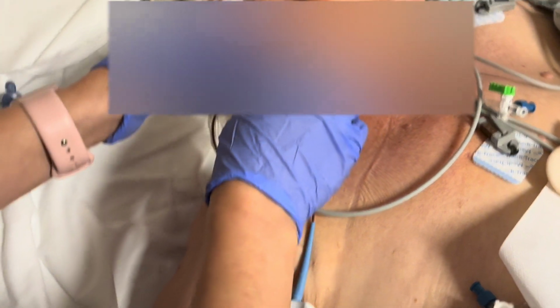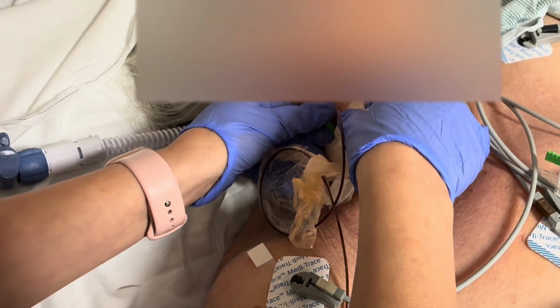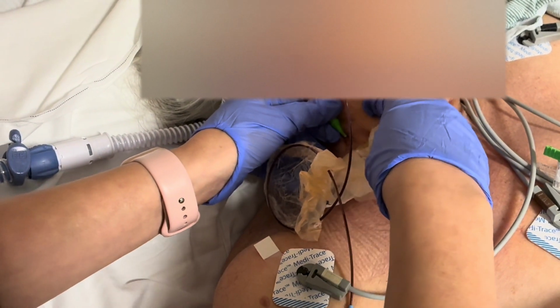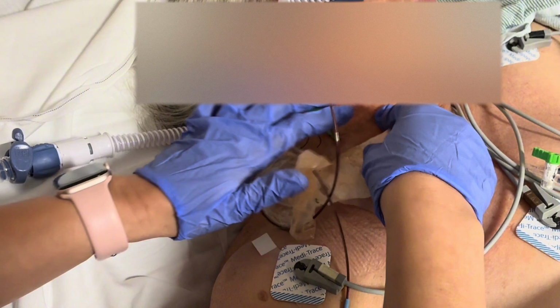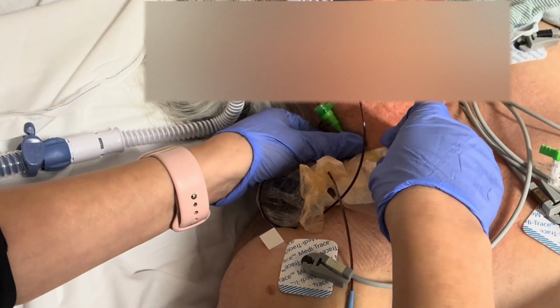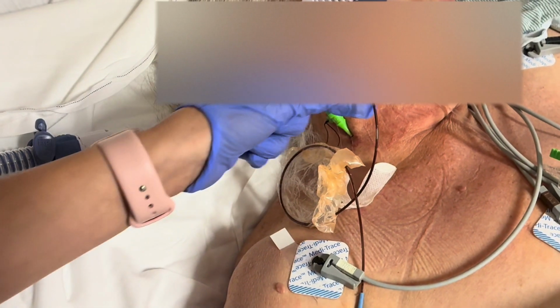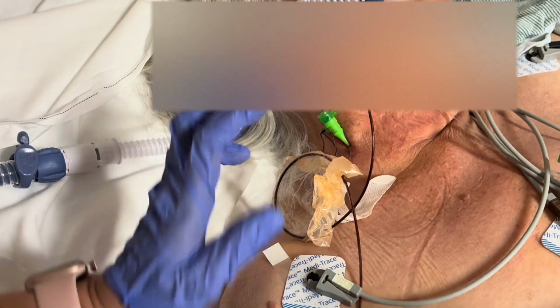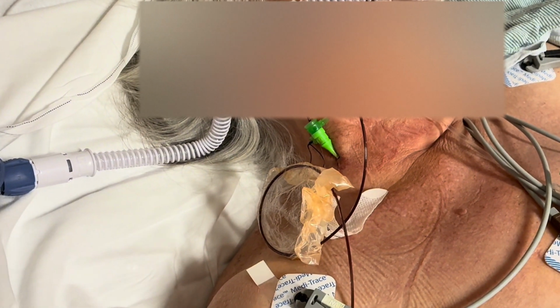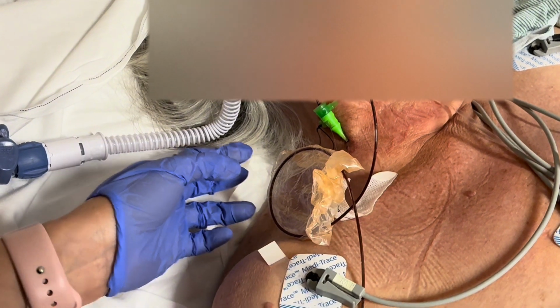So, again, this is an EKOS catheter that we're gonna take out. They usually do this in the cath lab. They use an ultrasound, so it's an ultrasound guided catheter placement. So it's a catheter directed thrombolysis. So this is your actual EKOS wire. So we already turned off the machine, all the infusions, your heparin, your saline, and your thrombolytics.